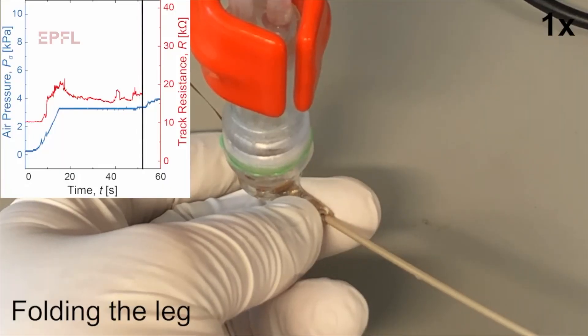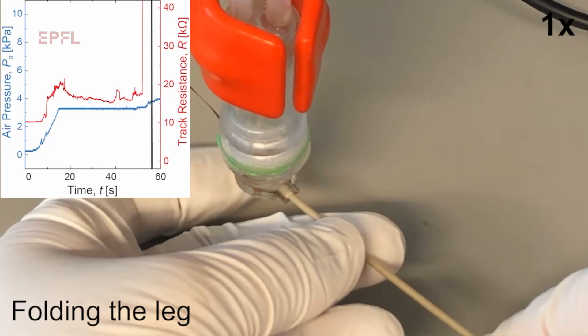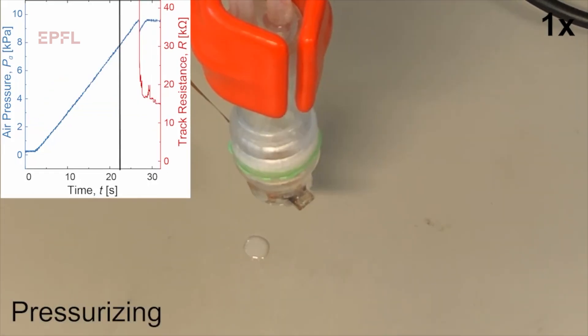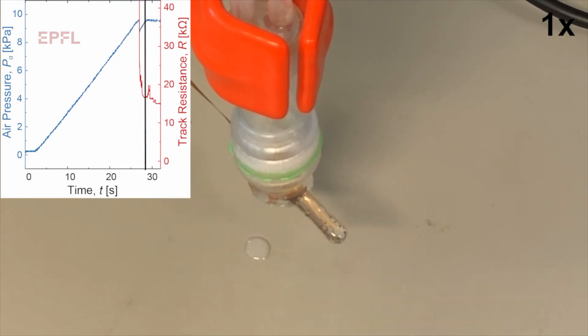If you consider that our soft electrode array is like a glove, each of the fingers corresponds to one of the arms of our electrode array. We have electrodes manufactured on each of the inner sides of the array. We first fold the electrode array just like you would fold your glove inside out, and then using a pressurized liquid, we apply a gentle pressure to help deploy each of the fingers right side out at the surface of the brain.